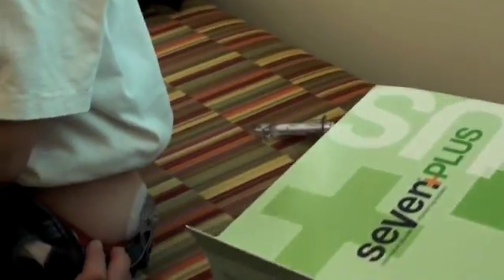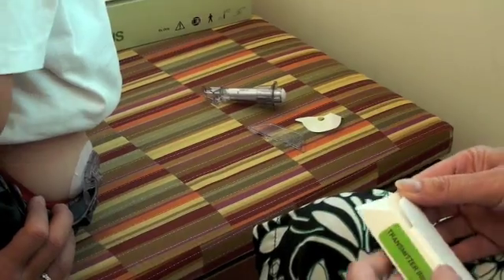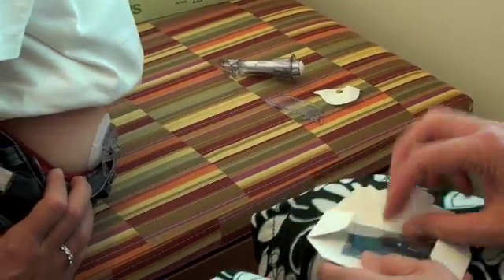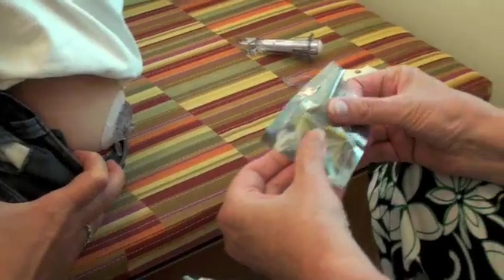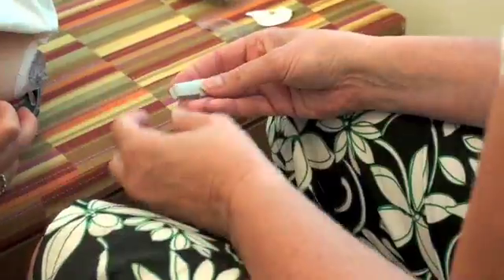Mom, that did not hurt. I'm so happy. And you know what? You don't get the Nintendo DS. Okay. I'm just kidding. You know what? I was thinking — now you don't get to say upper butt. It didn't hurt. Because if it hurt, I would be able to say upper. I can't say it.